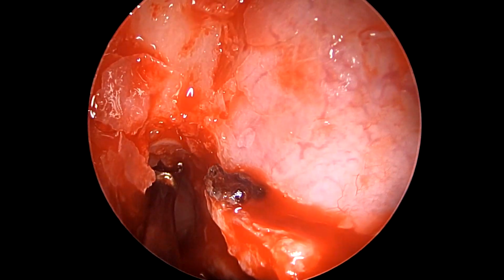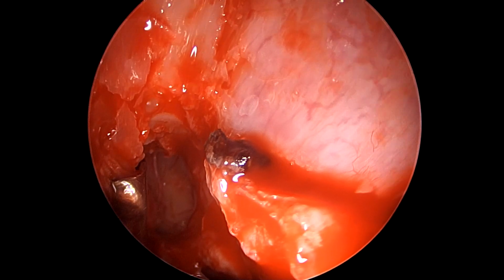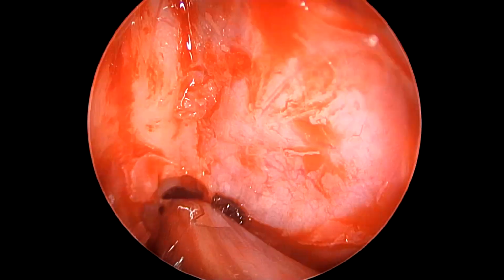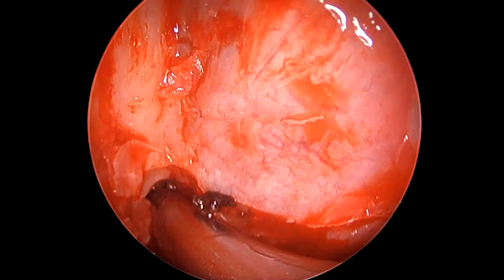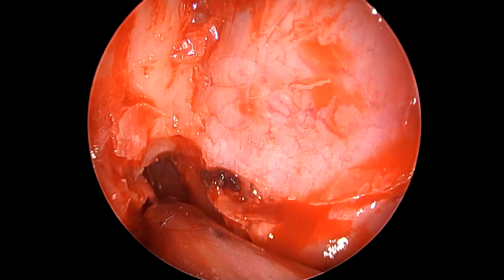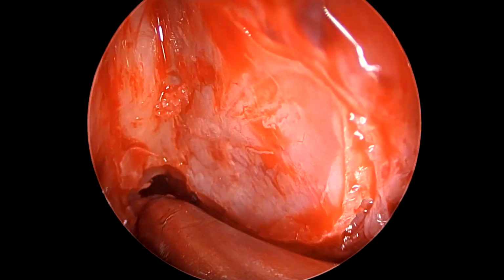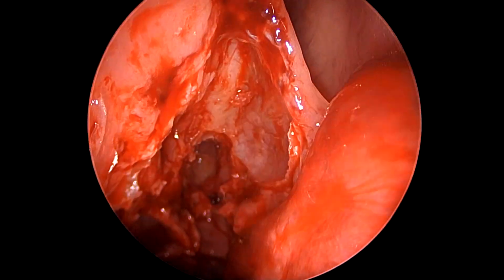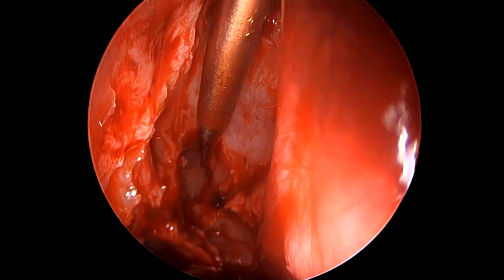As I had mentioned before, every millimeter of space that we create anteriorly is very important in allowing us instrumentation and vision inside. So we use a shaver blade that is curved 40 degrees upwards and strictly use it anteriorly. We must never use this blade posteriorly, because posteriorly we have the posterior table of the frontal sinus and we can create a CSF leak. So using it anteriorly, we shave off some excess bone and excess tissue.